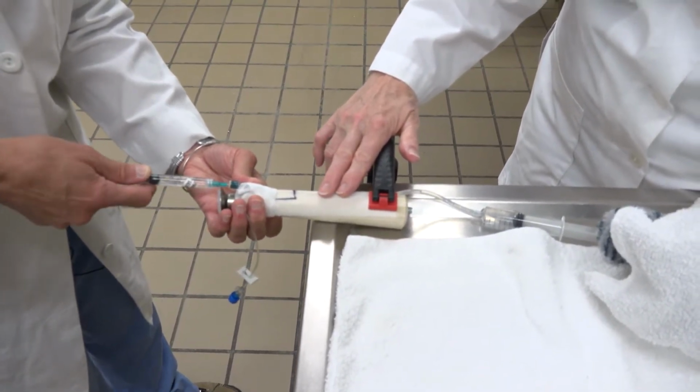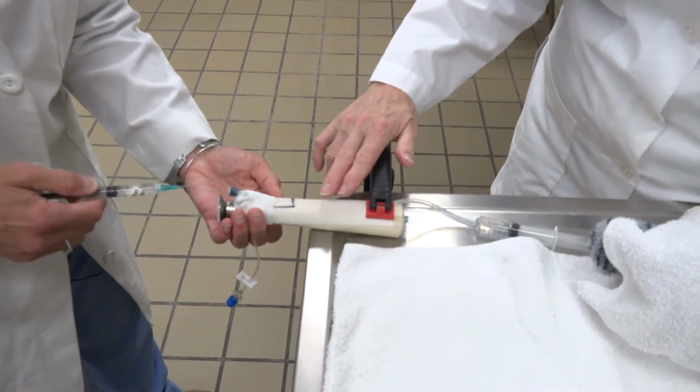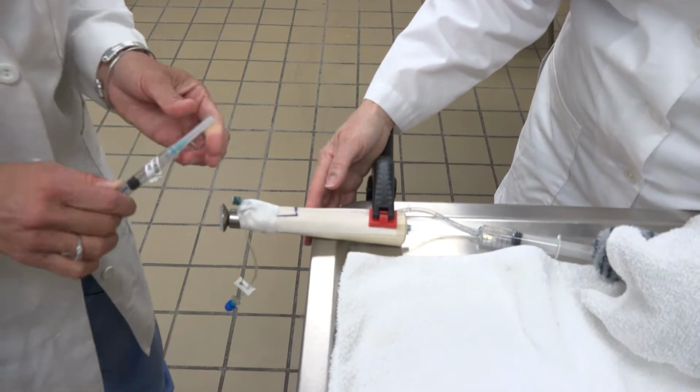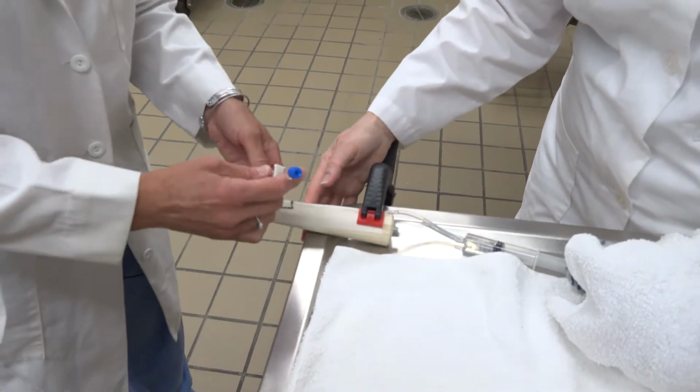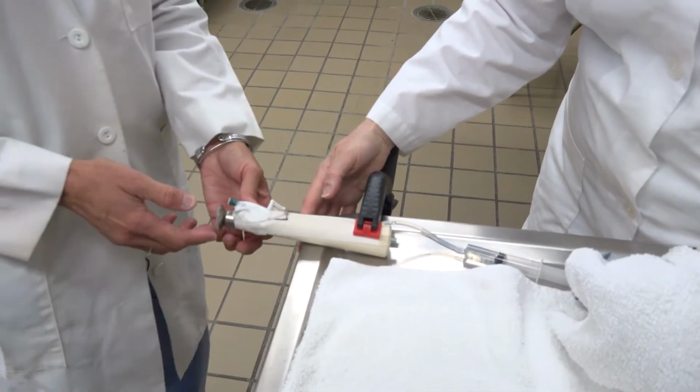Aspirate, yes, I have blood, and I'm going to pulse it. I feel it. You feel it? Mm-hmm. Great, we're in. Good job. I like to do that a little earlier, but that's all right. Our T-port's on. We'll maybe take some vet wrap, secure that.